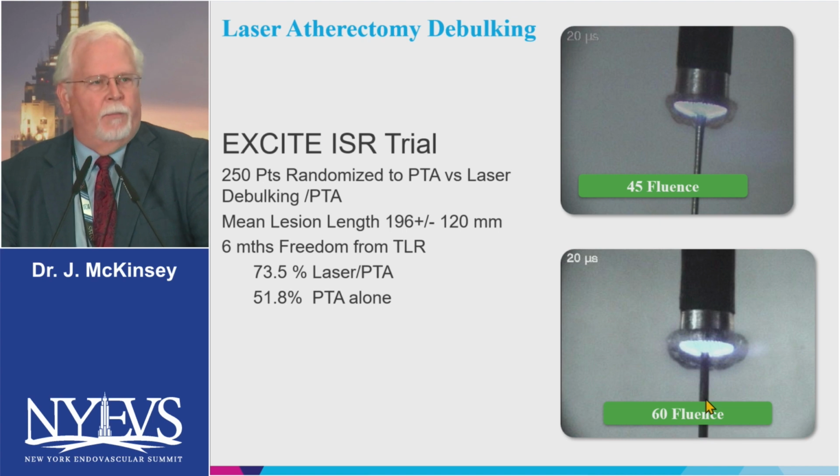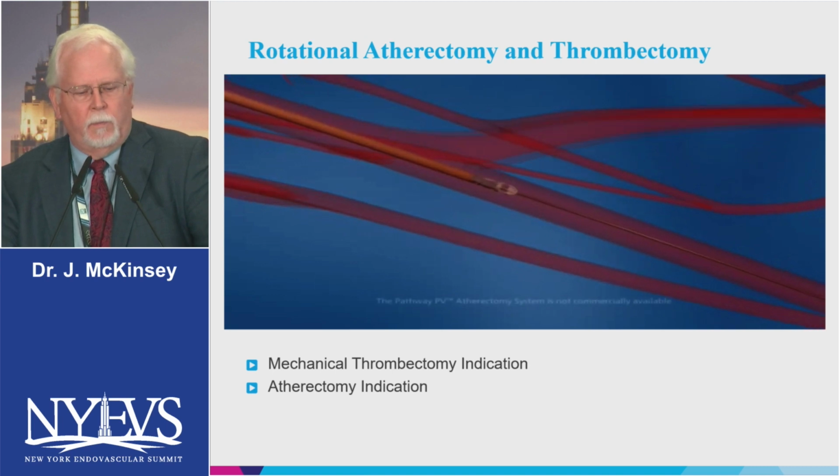That will give you better luminal gain. They also have laser fibers that will rotate on an eccentric path, and you can rotate around to give you further luminal gain with that. The EXCITE trial has already been mentioned, 250 patients randomized to angioplasty versus laser and angioplasty, and they found that at 6 months, the freedom from target lesion revascularization had a statistically significant advantage for laser over angioplasty alone.